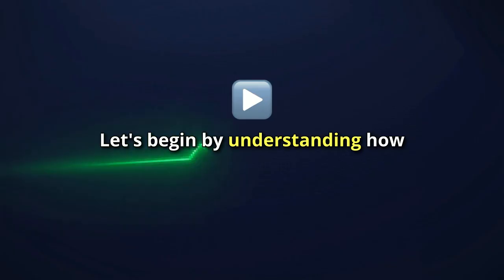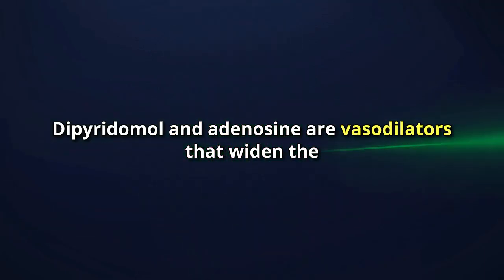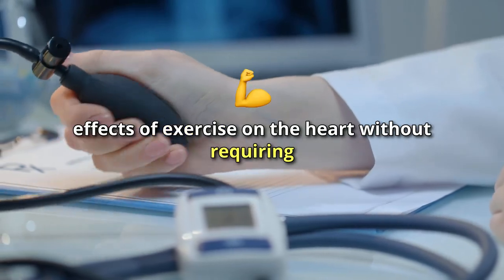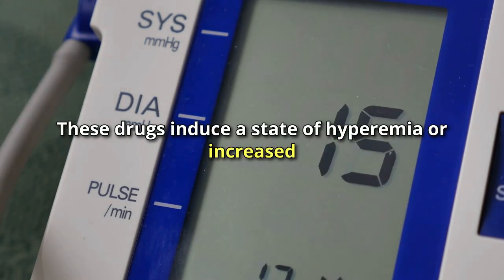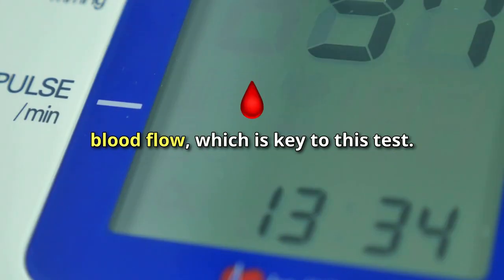Let's begin by understanding how the Vasodilator stress test works. Dipyridamole and adenosine are vasodilators that widen the coronary arteries, increasing blood flow and simulating the effects of exercise on the heart without requiring the patient to engage in physical activity. These drugs induce a state of hyperemia, or increased blood flow, which is key to this test.